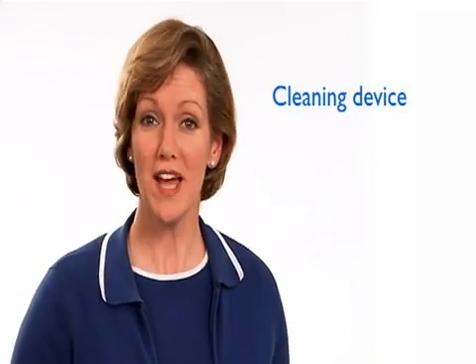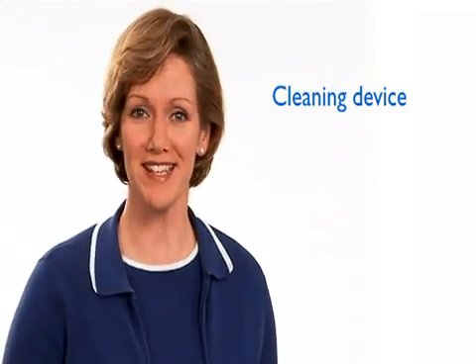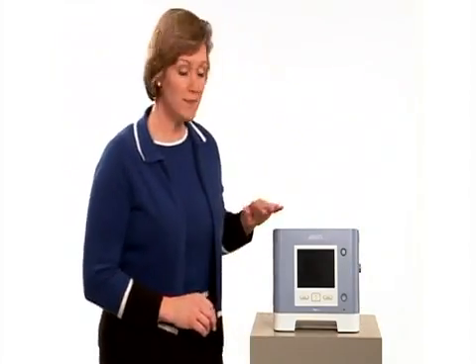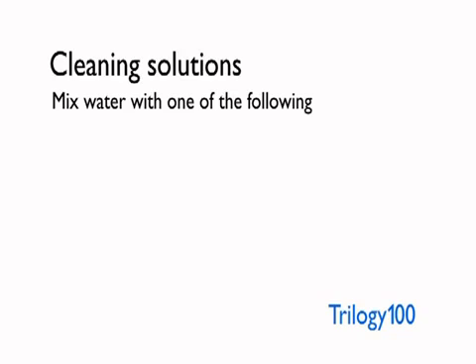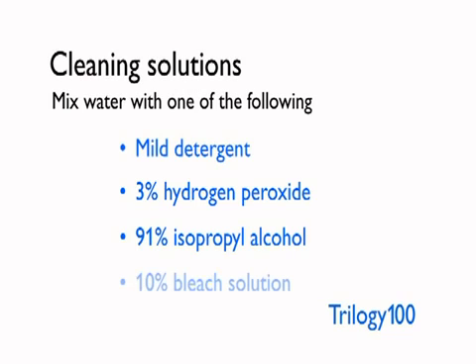The Trilogy100 ventilator is a medical device, so it is important to keep it clean. To avoid electrical shock, begin by unplugging the ventilator. You can wipe down the outside of Trilogy with water mixed with one of a number of different cleaners: mild detergent, 3% hydrogen peroxide, 91% isopropyl alcohol, or a 10% bleach solution.